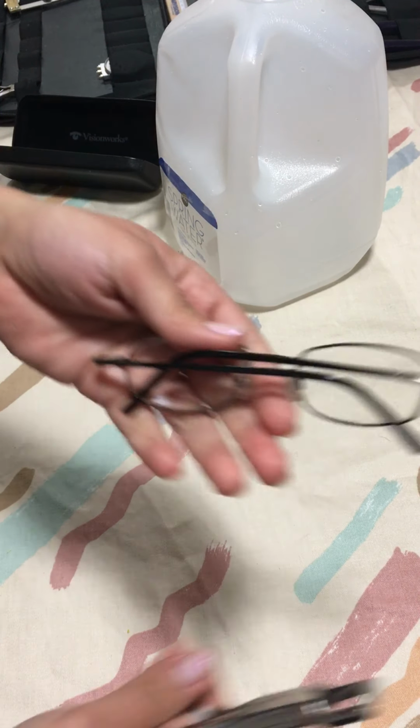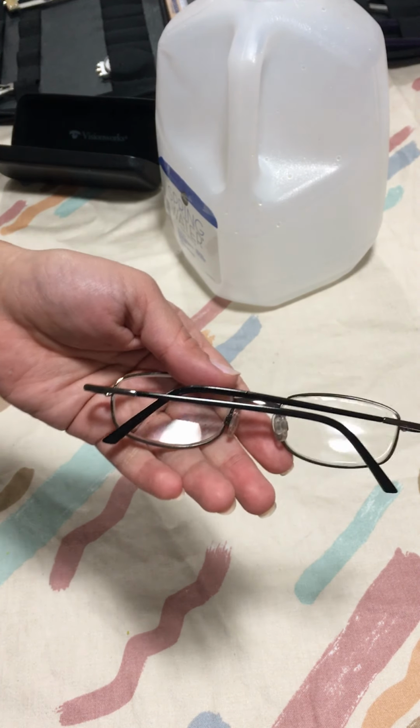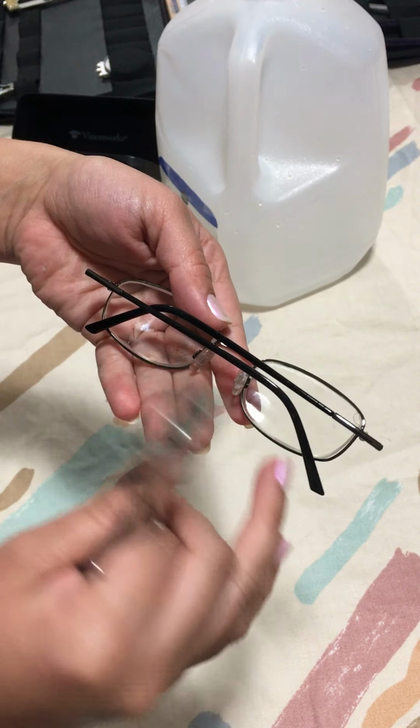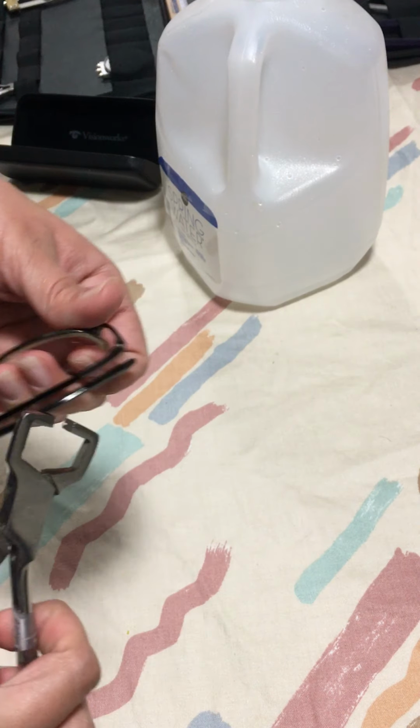Okay, see, now it's looking a lot better. So now I did this one. I'm gonna do a little bit more on this temple side. So I'm gonna do a little bit more on the left temple. Okay, so I am going to hold it up here a little bit. Let me see. Okay, so I did good on the left side. Now I'm gonna push the right side a little bit down.